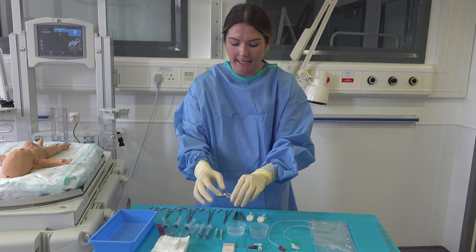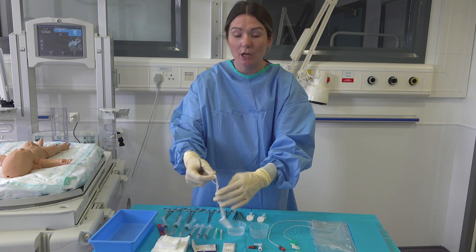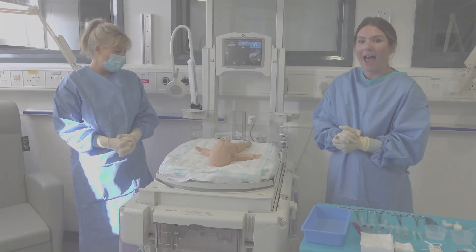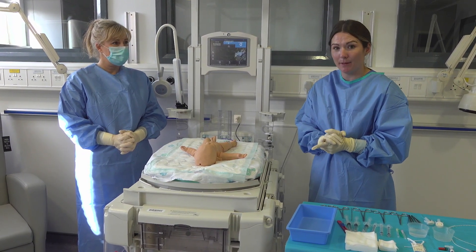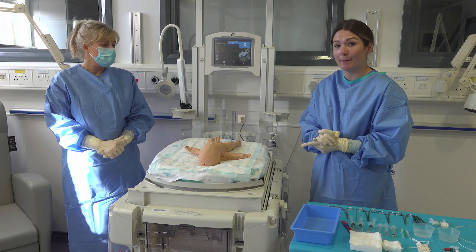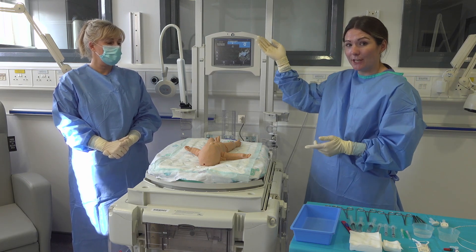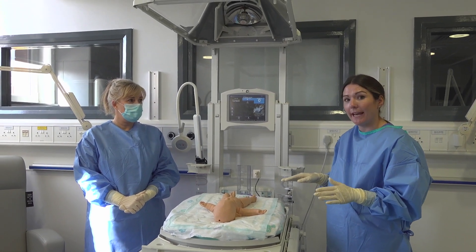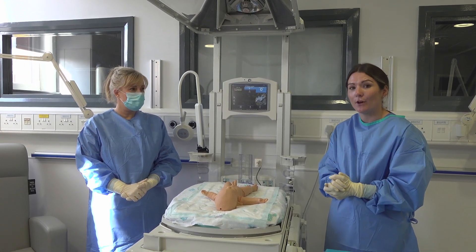I then take my tape and using my scissors I cut a small portion of the tape to put around the base of the umbilical cord. Before starting the procedure we want to check that the baby is stable with a stable airway, a servo in situ to ensure that the baby's temperature remains normal, and ensure your overhead heater is working and on. We only ever do this procedure in the incubator with the top raised to ensure that your sterile field remains intact.